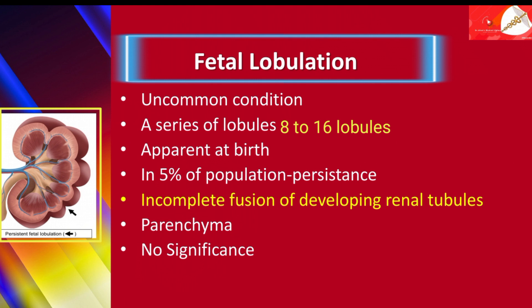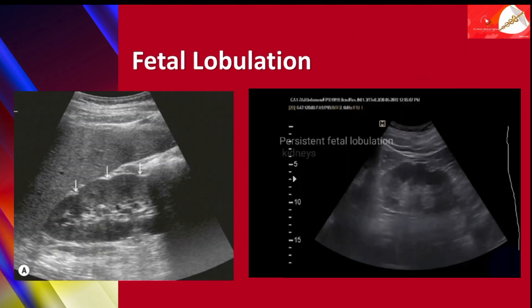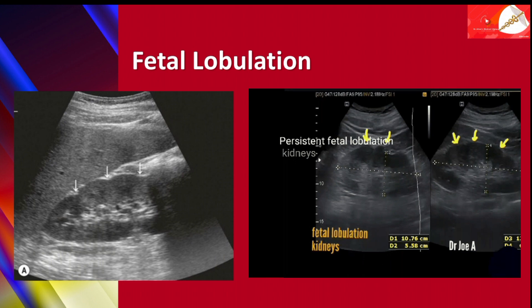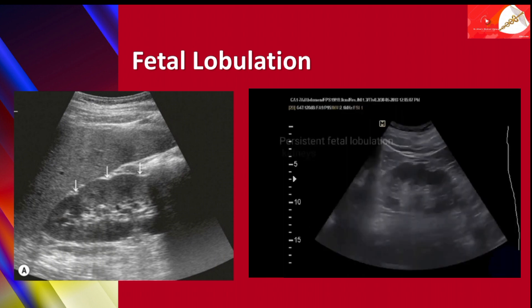Characteristically, in persistent fetal lobulation, the parenchyma is of normal thickness. Fetal lobulation is of no clinical significance. In this ultrasound, you can see characteristic indentations on the outer surface of the cortex, giving a shape of lobules.